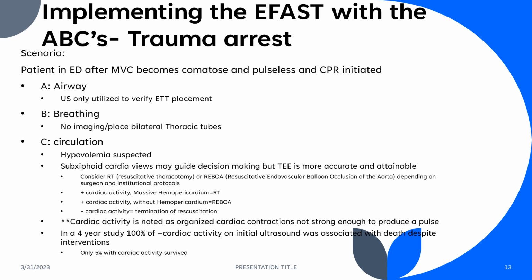Now, you might ask why we just mentioned that this patient was pulseless, and yet we're referring to positive and negative cardiac activity. Obviously, it would be if that cardiac activity was too weak or there was so much tamponade that it was not able to produce a pulse. It doesn't mean that the heart is still not functioning, at least to a certain extent.